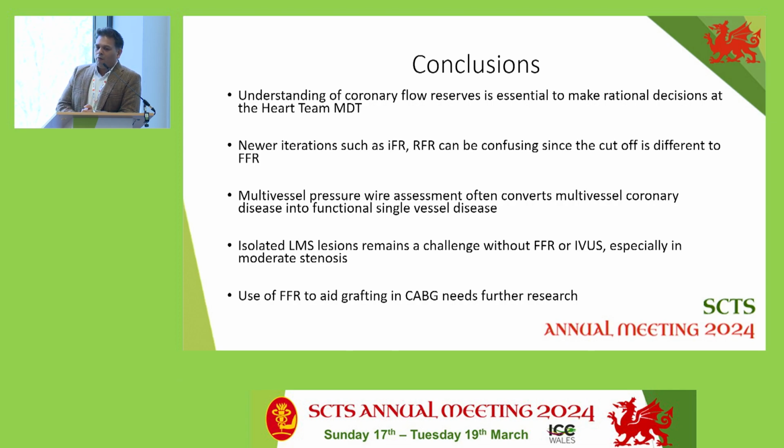Newer iterations of the techniques such as iFR and RFR can be confusing, and the cutoff for that is 0.89. Multi-vessel pressure wire guidance often converts multi-vessel coronary disease into functionally single-vessel coronary disease, and of all the things we discussed, I think that is, in my practice, the most utility of FFR. If I want to do PCI, you can convert multi-vessel disease into single-vessel disease.